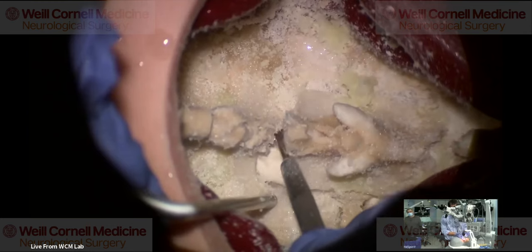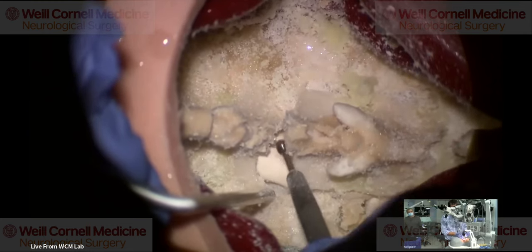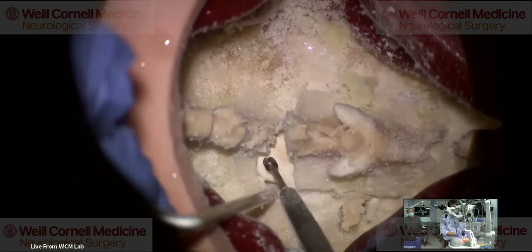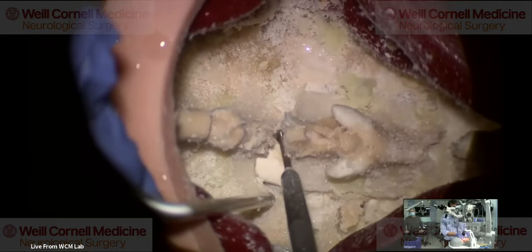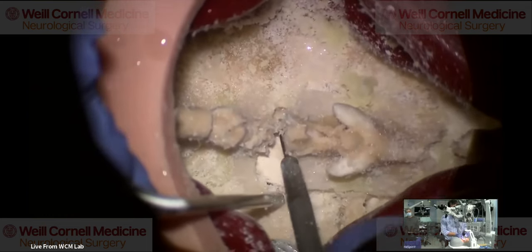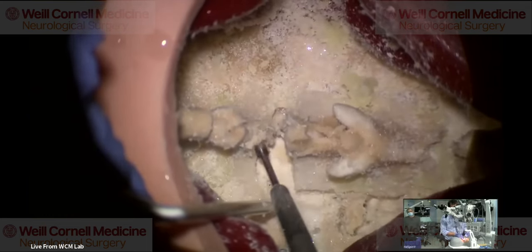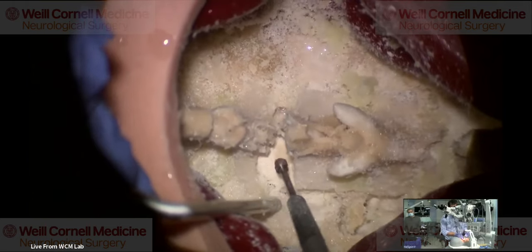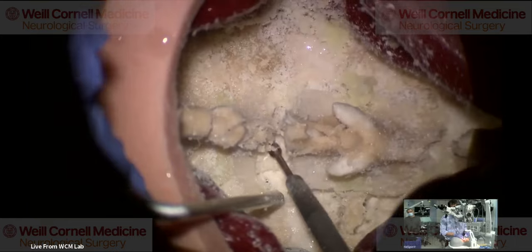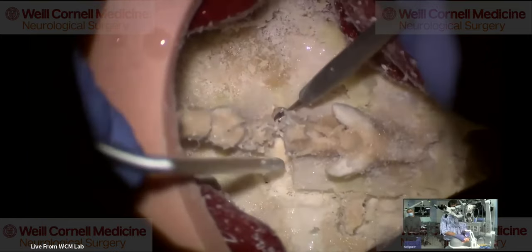The other thing you can do sometimes is if you're really afraid of the kyphosis, you can flip the patient over, either at that time or later, and just do an ACDF at the C6-7 level, especially if they're already a little bit kyphotic. And then, as I said, I don't want to go up into the spinous process, so I'm just undercutting and doing a dome laminoplasty over here and coming across like that.